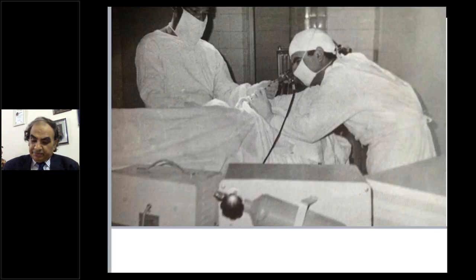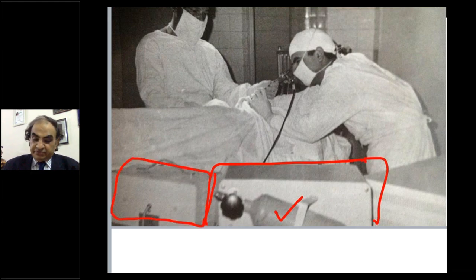Now, this is the equipment that we had in those days, which is very basic. You should be familiar with it. The carbon dioxide cylinder is right here, a small amount, and that's the cystoscope connector which we had to use when we started. And you can see that I've not yet used the second port. This is the previous picture. This is the first picture.